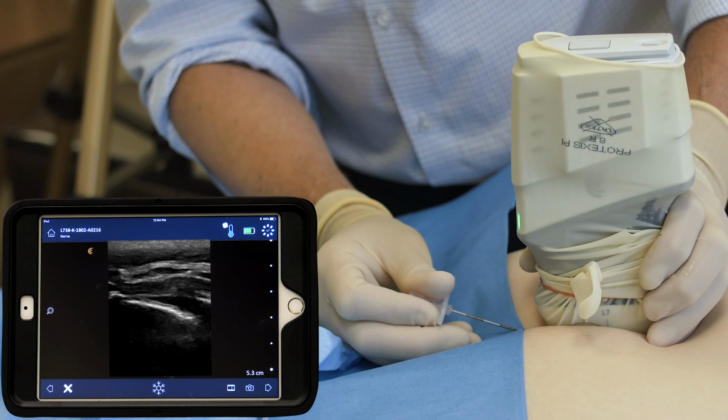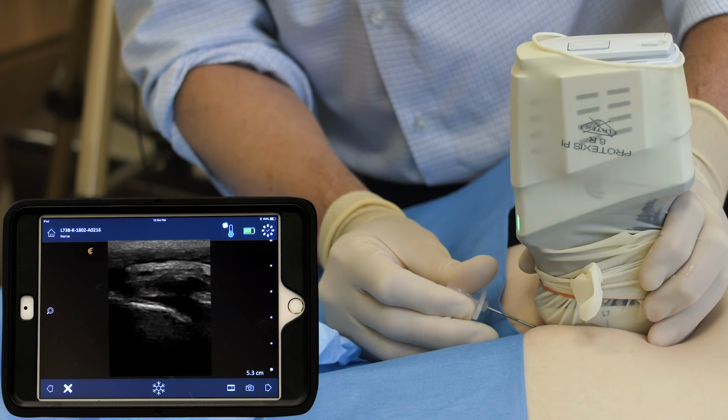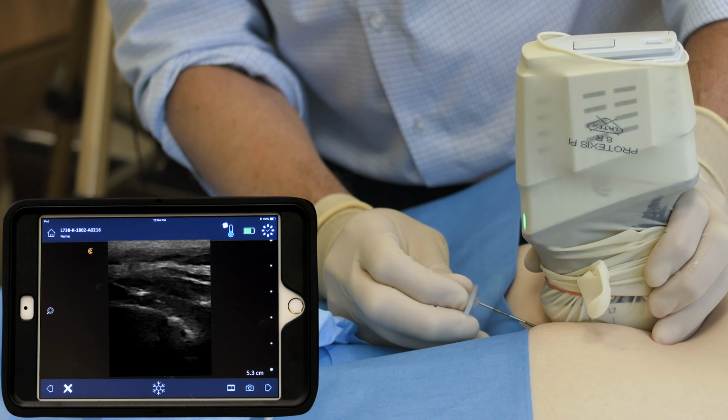And advancing the needle into the caudal space. And we're going to pop into the epidural space. Wireless ultrasound enables me to focus more on my patient without having wires get in the way of my nerve block. And insert into the caudal space as such.